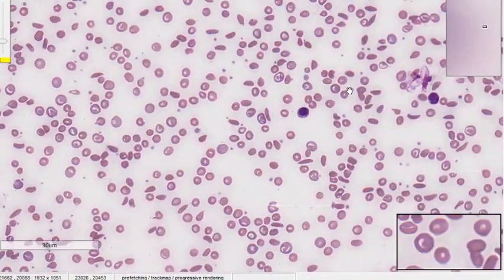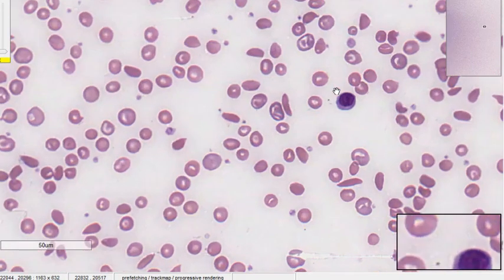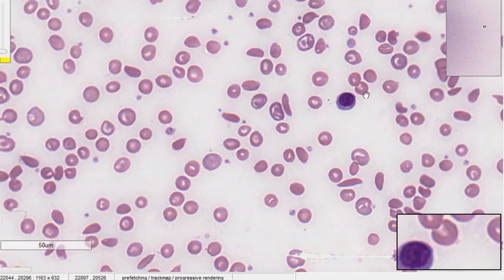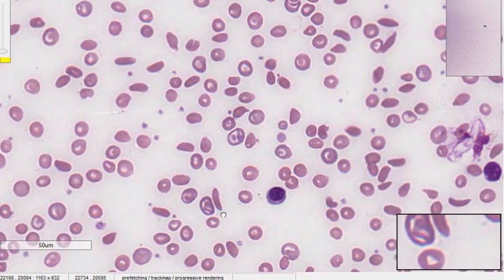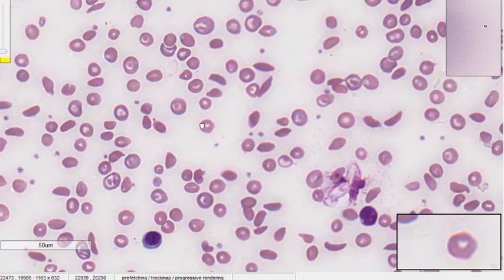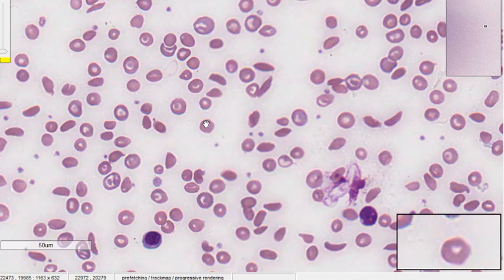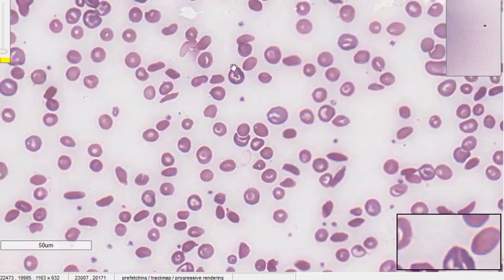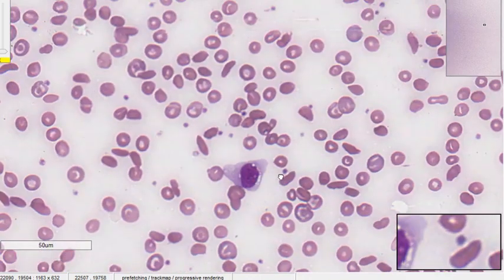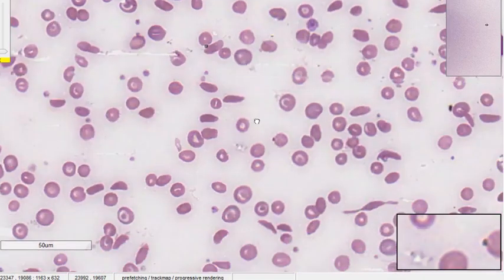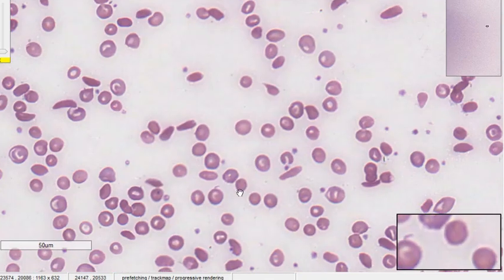First we look at the morphology of the RBCs. The normal description is normocytic normochromic — meaning normal size and normal chromia, that is, normal hemoglobin content. The color of the RBC is determined by the hemoglobin it carries.